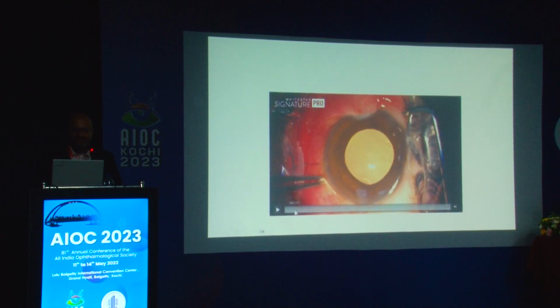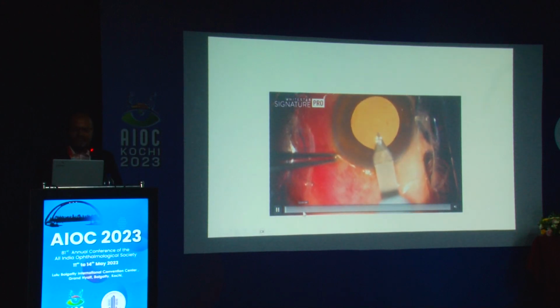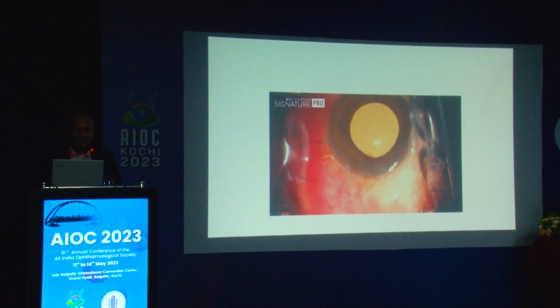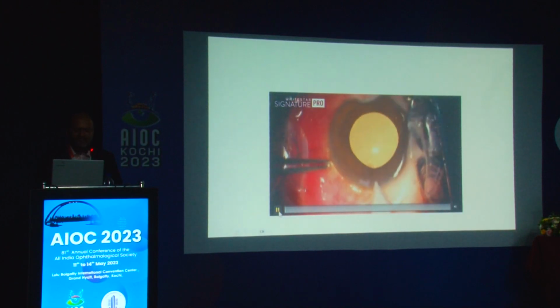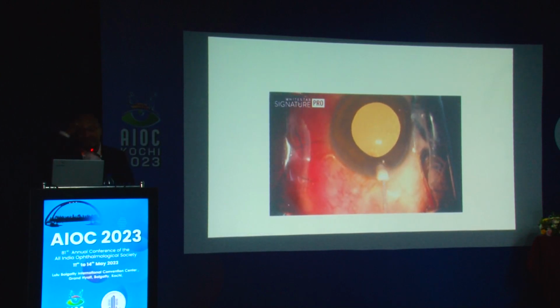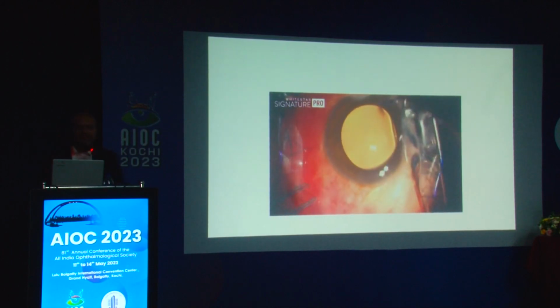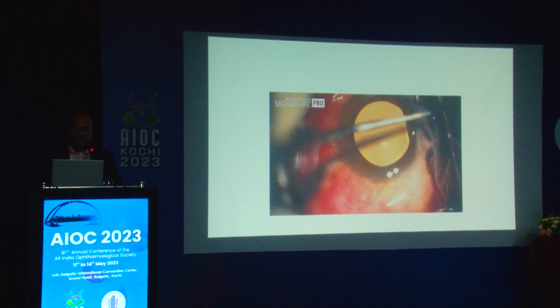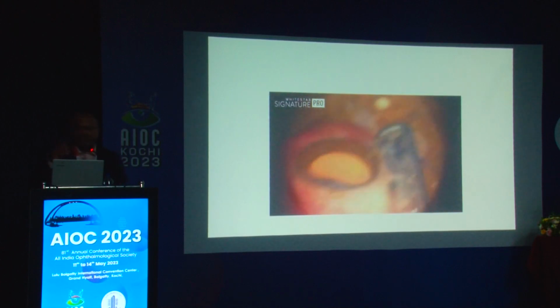So this is another patient who came to us about after 1 year of the other eye. So this is how you initiate the surgery. The patients I'm showing you are phakic eyes. Most of them are juvenile glaucomas or early POAGs. Once you introduce the suture through the side port, I always try to place the side port supranasally or infranasally.